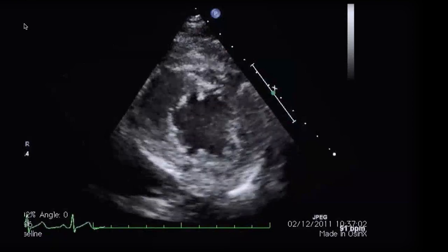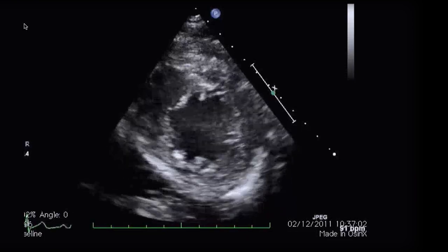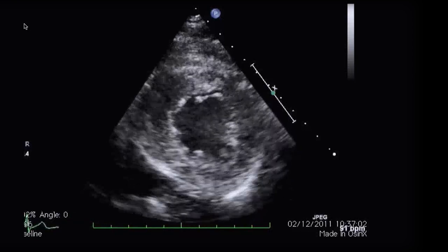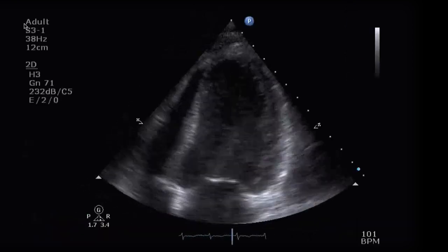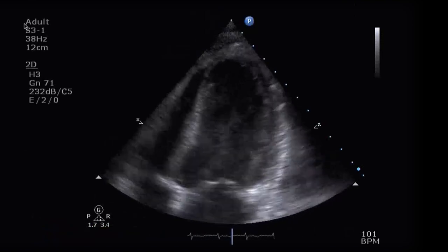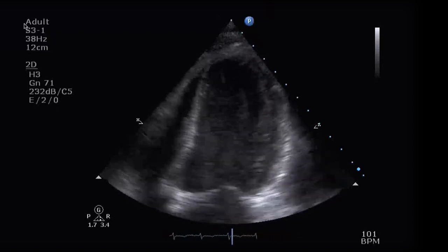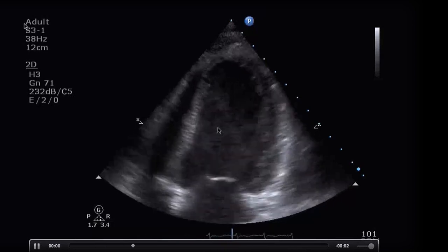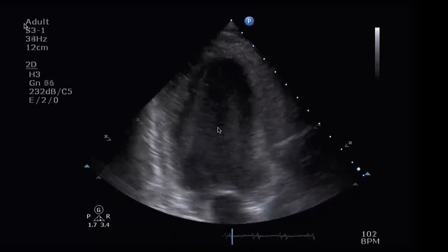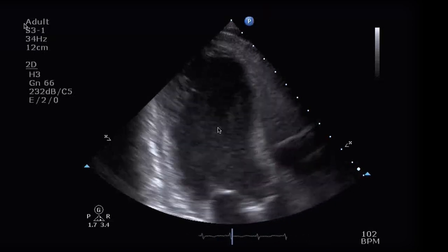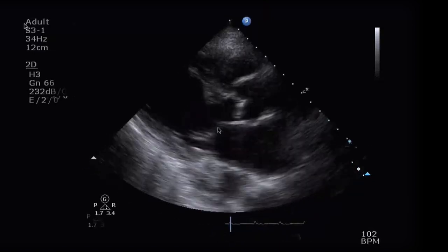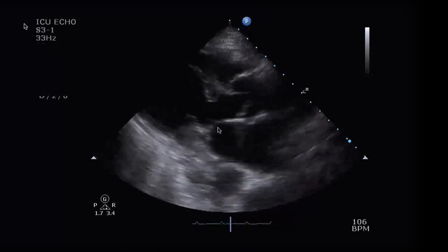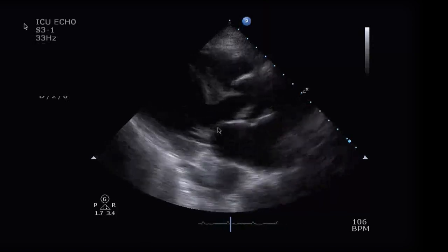This is the most frequent injury I see in ICU patients. You may be the first person to consider it because of what you've seen on ultrasound. It doesn't guarantee everything is completely acute — that's a clinical assessment — but it gets cardiologists' attention when trying to get them to take patients to the cath lab. Another patient also shows signs of acute LAD infarction, plus swirling spontaneous echo contrast — a terrible finding indicating seriously slow flow and ischemic cardiogenic failure.